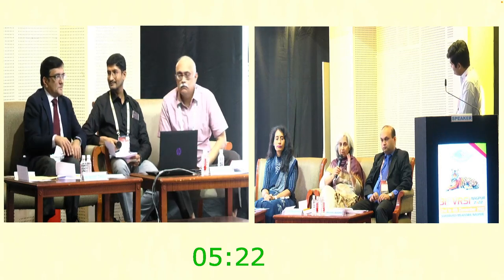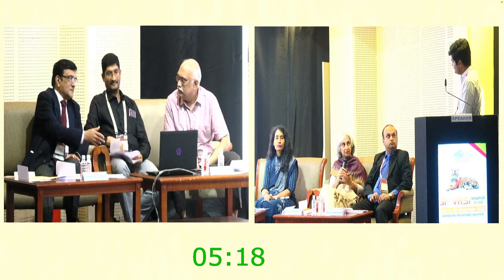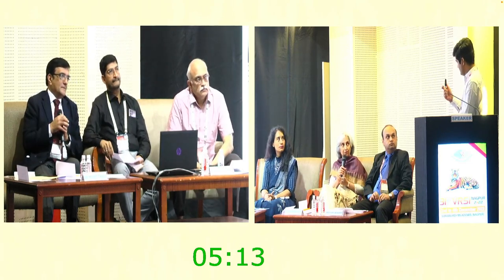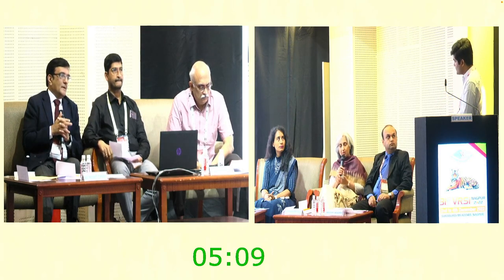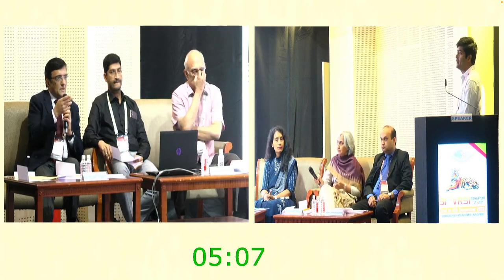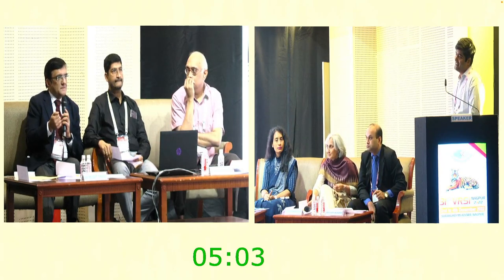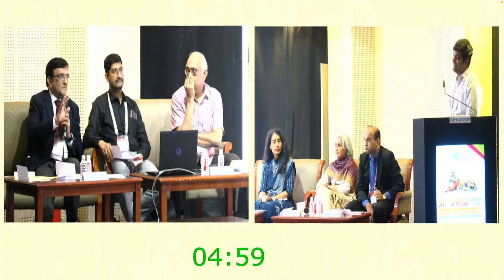I would have thought it's more like a clear fluid that has gone in than crystals. I had no doubt when I looked at the picture. You can see it in the image as well. I must congratulate you for getting those pictures, because we have tried getting pictures immediately after injection. By the time we get the patient from the OT to the UBM, it disperses so rapidly.